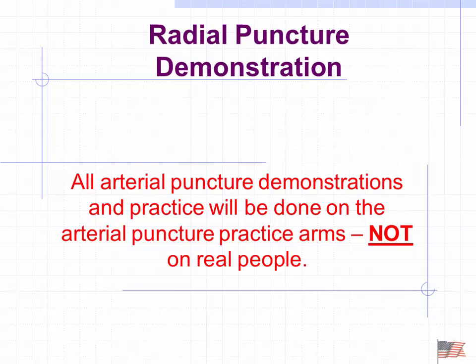Because I got a question. With a brachial, would we go with a larger gauge? You might go with a little bit of a larger gauge, yes. And you may need to go slightly deeper than the radial. I hate brachials. When I was starting out, only supervisors could do a brachial, so I got very good at doing radials. We used to do 15, 20 blood gases a day, and they were all radials, and you got very good at it.